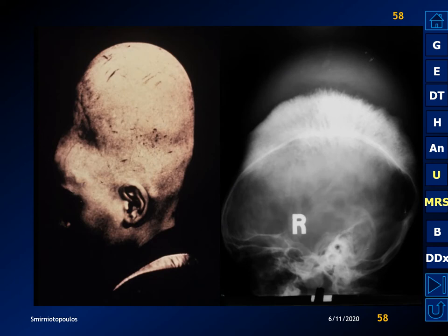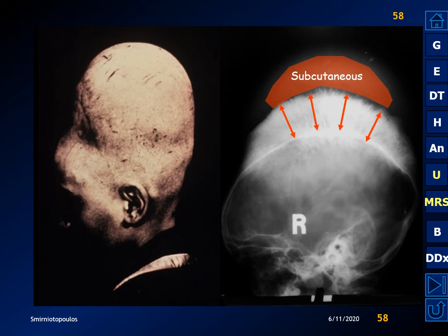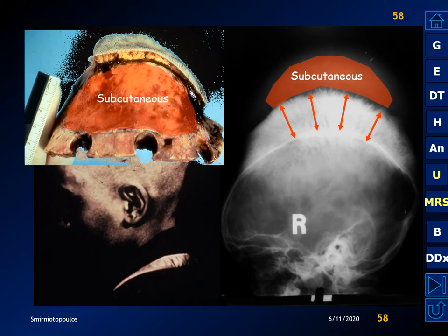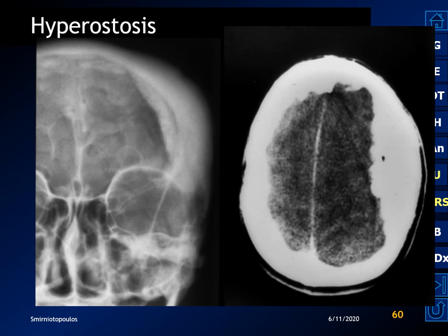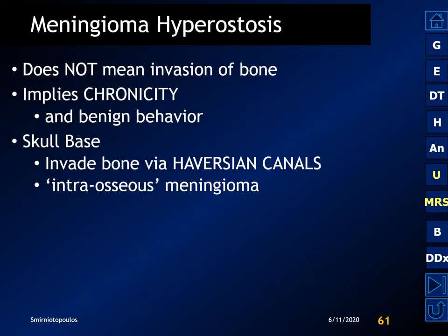Here's a dramatic example of hyperostosis in a 16-year-old girl with a spiculated hair-on-end appearance in the calvarium, widening of the diploic space, and extension of the tumor into the scalp. These features, as ominous as they appear, do not predict a more aggressive histology and can be seen with ordinary grade 1 meningiomas. There's also a ground-glass pattern of hyperostosis that can be confused with fibrous dysplasia. Hyperostosis does not always mean invasion of bone. In the skull base the meningioma may invade bone using the Haversian canals — sometimes called an intraosseous meningioma.